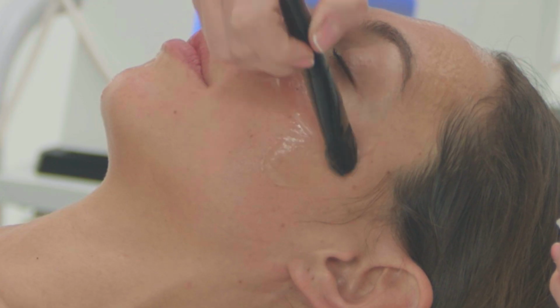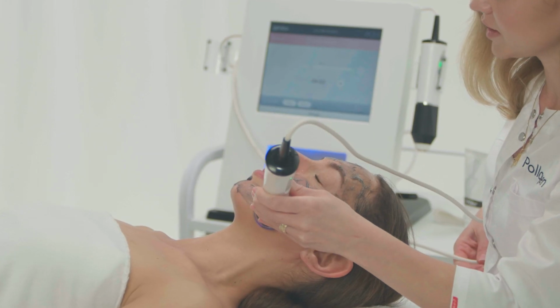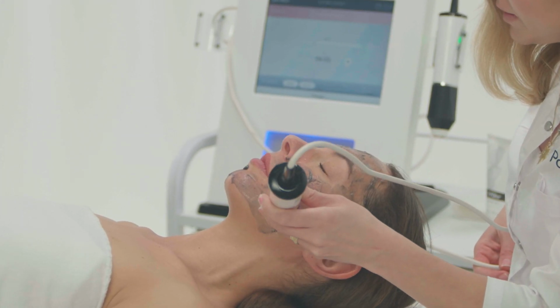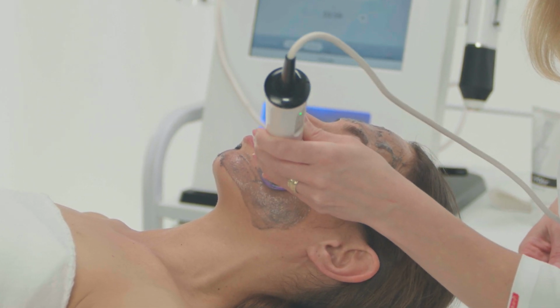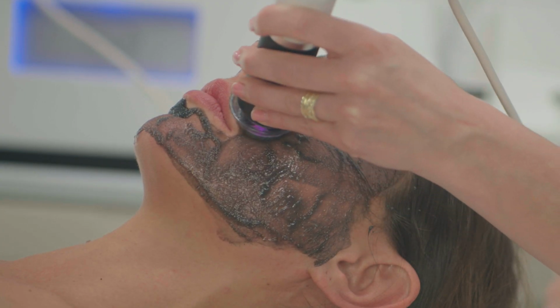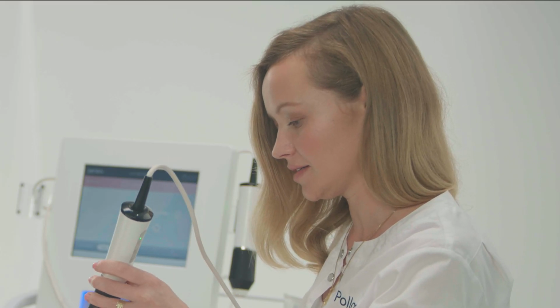Add more gel to the treated area if needed and continue treatment. To adjust the intensity, press the +- button on the applicator. About 2 minutes into the session, the OxyPod becomes grainy. Communicate with the patient for feedback and reduce pressure if needed.